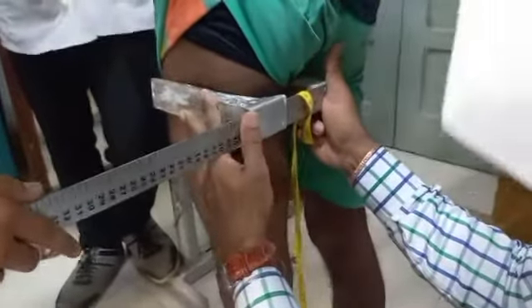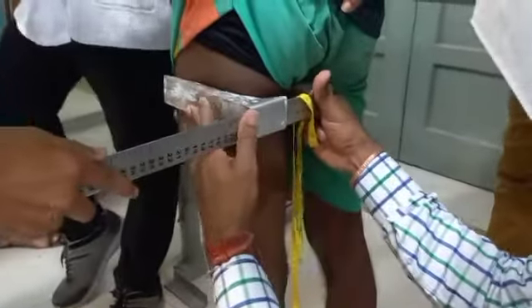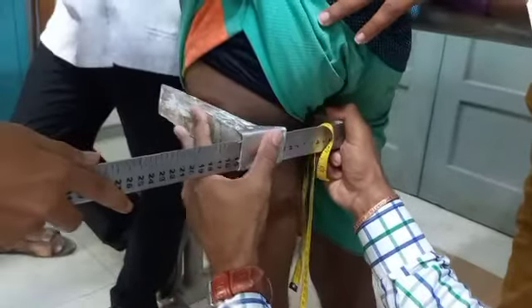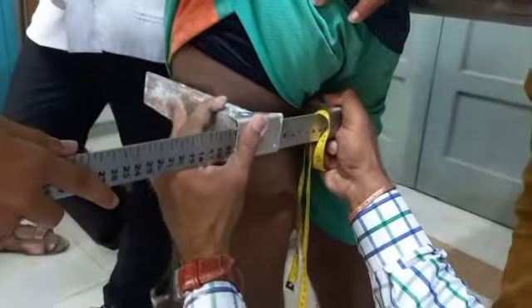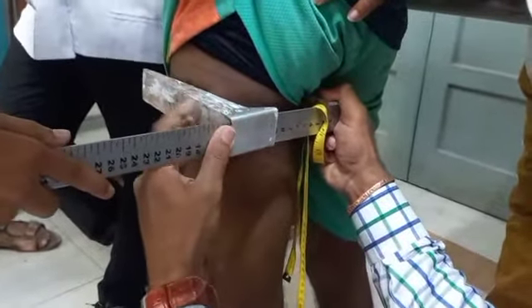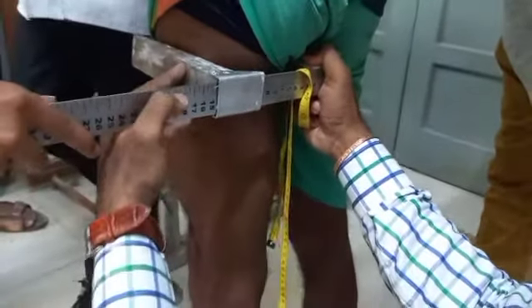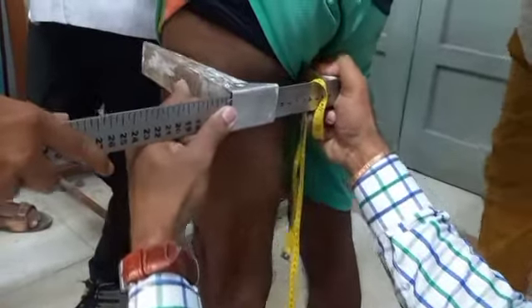Right. Now ml soft tissue is at least 4 centimeters down. So at our first measurement level, at that measurement, our soft tissue ml. So I'm just loading it, keeping my scale in the coronal plane, compressing, asking the patient to do the muscle tightness. Muscle tight. Okay. So it is coming out to be 14.5. So I'm keeping it in the 14.5 position and again measuring the tape measurement.